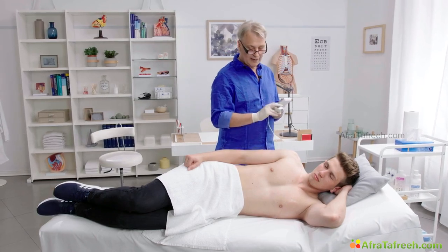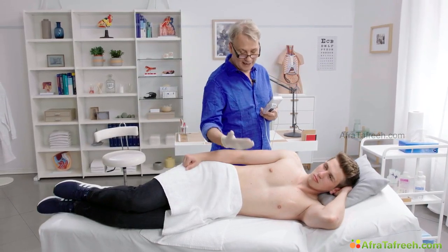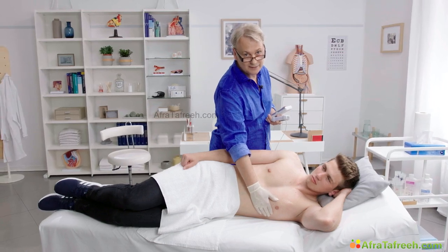Very important, we have to first locate the apex. You can get a better feeling if you try to palpate where the apex is. And especially in young and slim individuals, you can feel where the apex is.